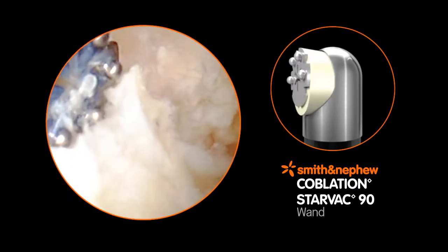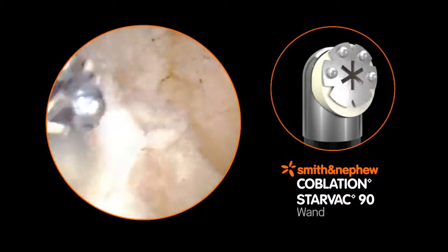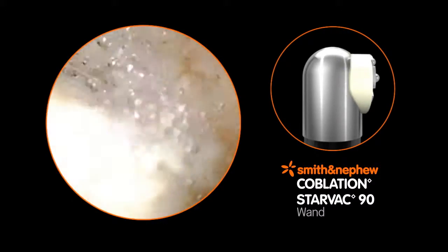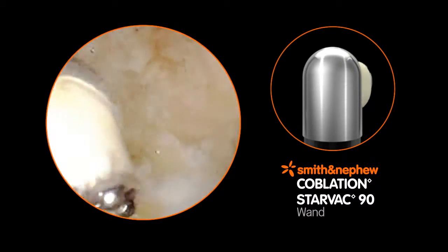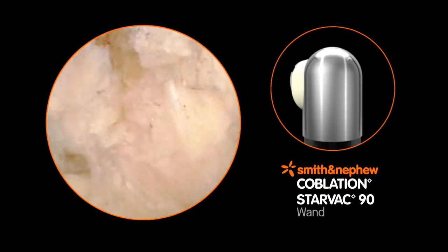The Star Vac 90 wand provides an innovative star screen design to combine aggressive ablation speed with powerful suction. The Classic 90 wand tip profile is optimized for easy access and precise ablation and hemostasis.